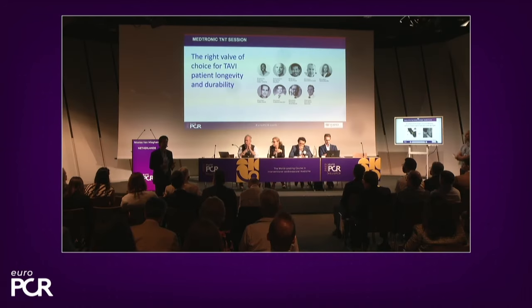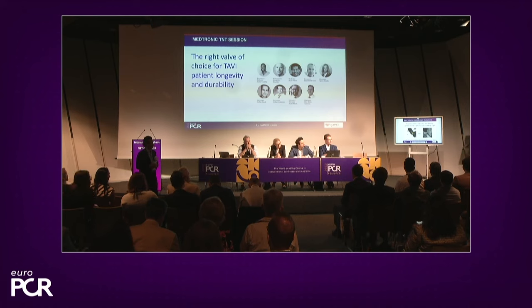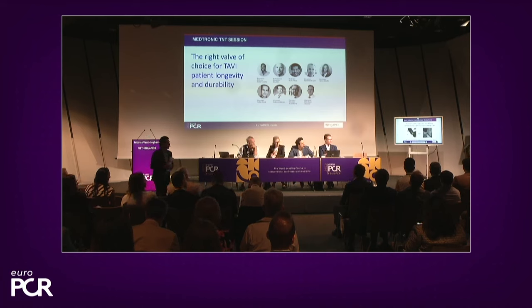Yeah, so, you know, I think one thing that we have to make sure, if we're going to be doing TAVI in younger and lower risk patients, we have to really understand the technical difficulty and the challenges that we might encounter with the patient. So the CT scan really becomes an important piece of the puzzle in all of this. So Nicolas, then when you look at the Optimize Pro and Forward Pro data that were presented yesterday, we do see that more than mild PVL hardly exists with the current generation platform.